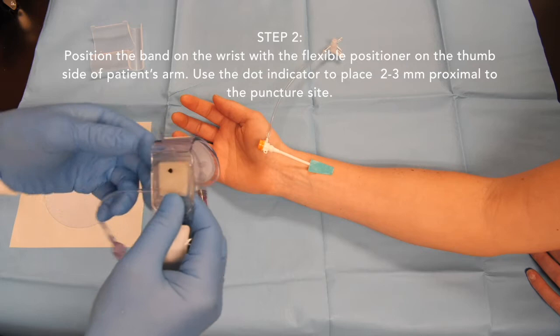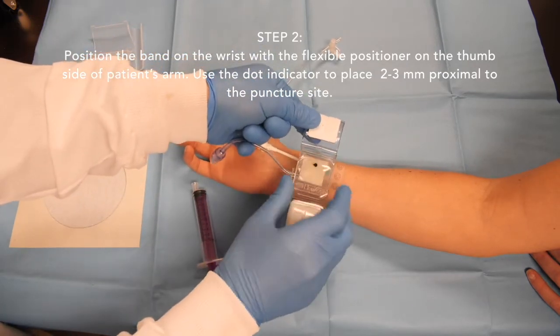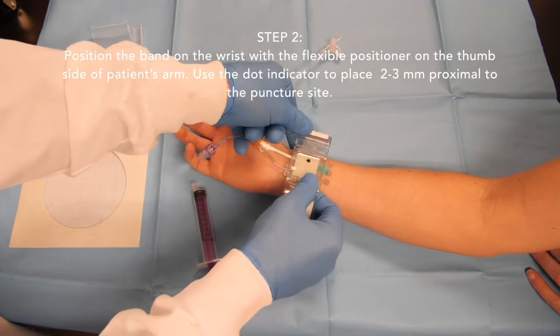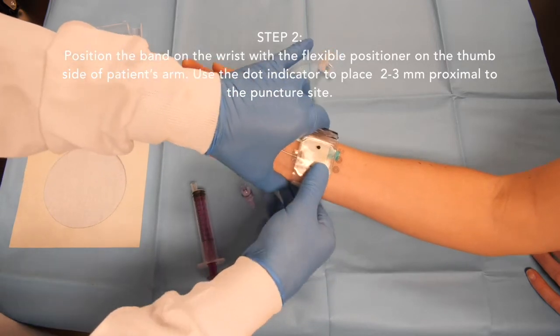Place the band on the wrist with the flexible positioner on the thumb side of the patient's arm. Position the dot indicator 2-3 mm proximal to the puncture site.